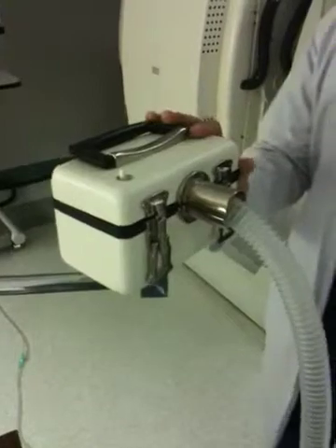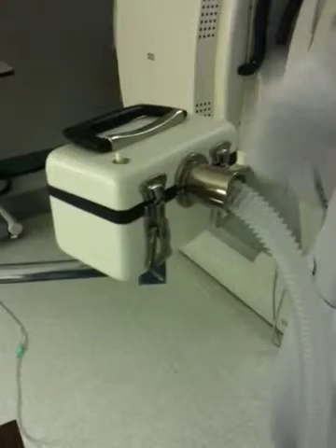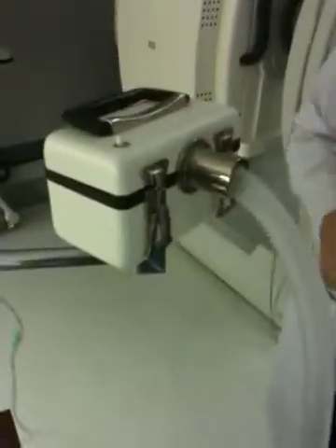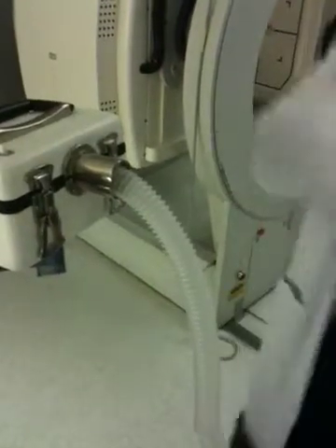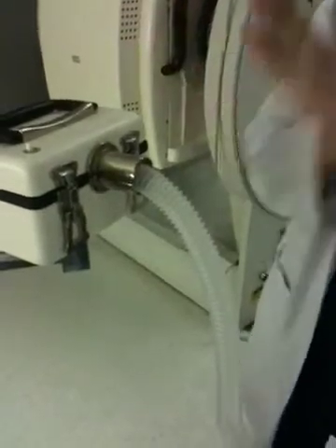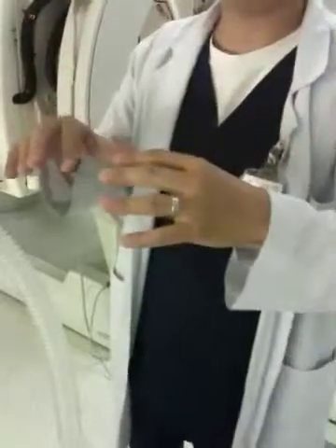Usually I don't dispose of it right away because you never know if the patient took a good breath. If you don't get enough good counts, bring him back to the gurney and have him breathe some more. After he finishes on the gurney, put it on the table, then you do 200,000 counts: RPO, LPO, left lateral, posterior, anterior, right lateral — just the same 6 views you do with the perfusion. Each one at 200,000 counts.